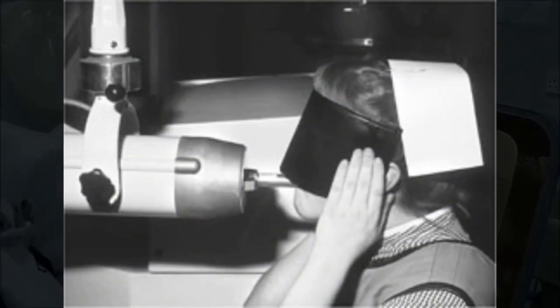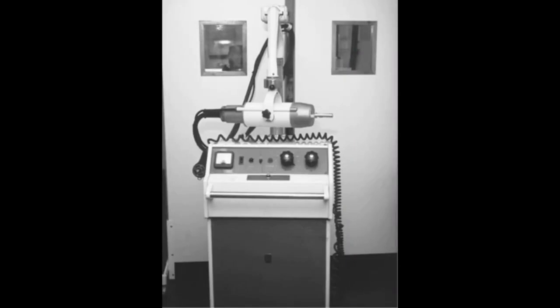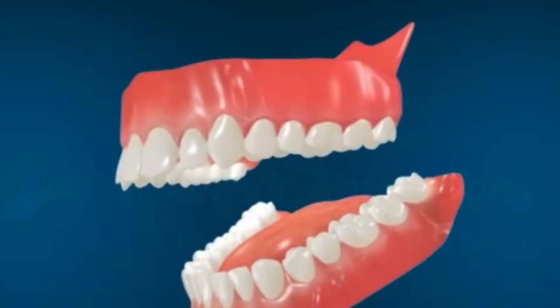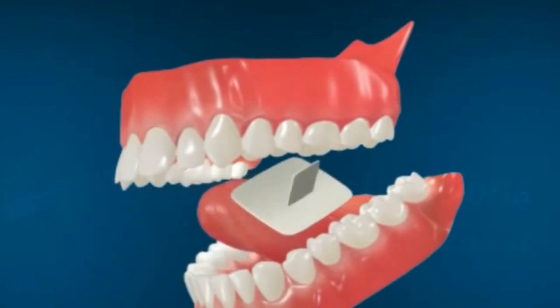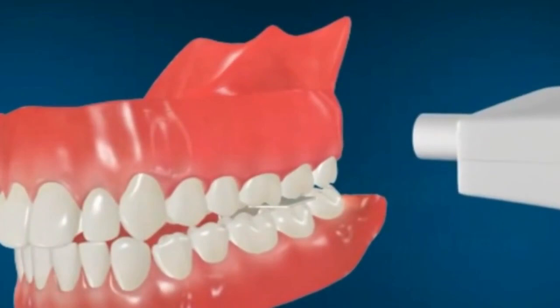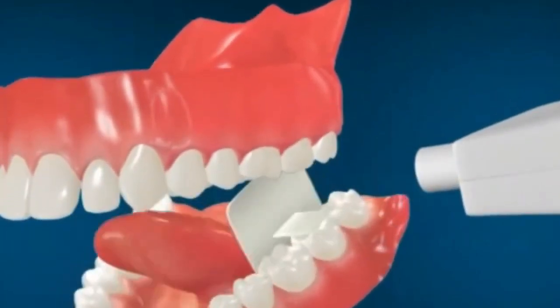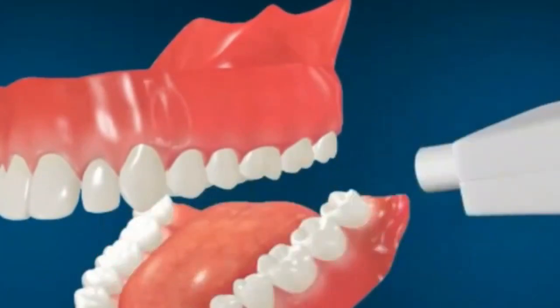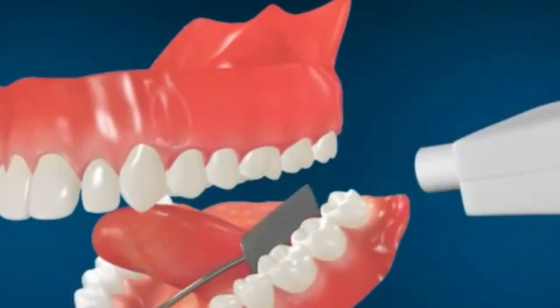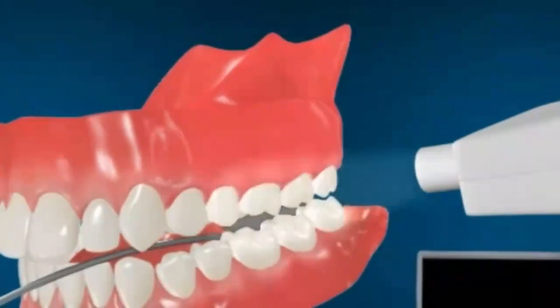Further interest in this field of research did not resurface for another 20 years and resulted in the development of X-ray equipment using two quite different radiographic techniques to produce an overall image of the jaws. One group of researchers developed a small X-ray source which, when positioned intraorally, would directly expose an X-ray film molded to the outside of the patient's face. The other group relied upon the production of a tomographic image of the jaws with the tube positioned extraorally, combined with either an intraorally or an extraorally positioned film, or orthopantomograph.